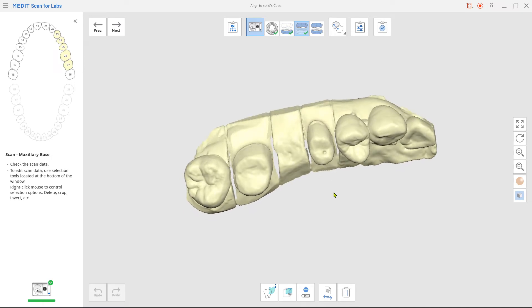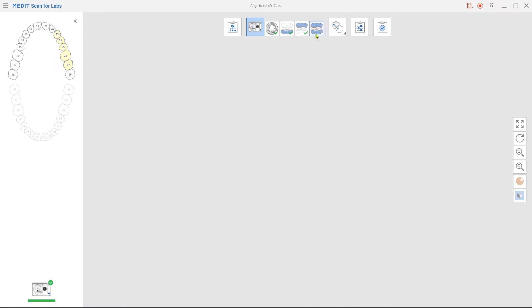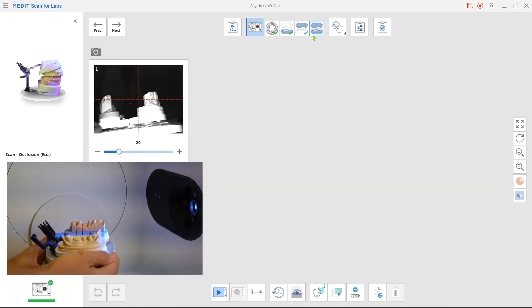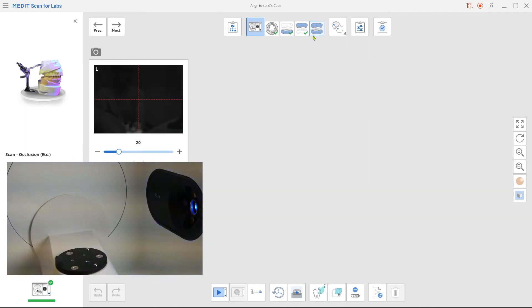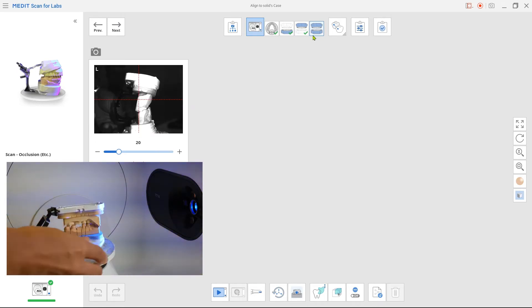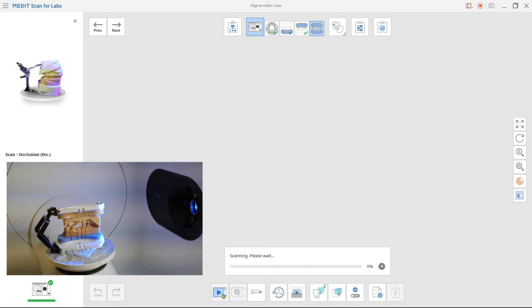Move on to the occlusion scan. Have your upper and lower model be in occlusion and place on the jig. Perform the scan.